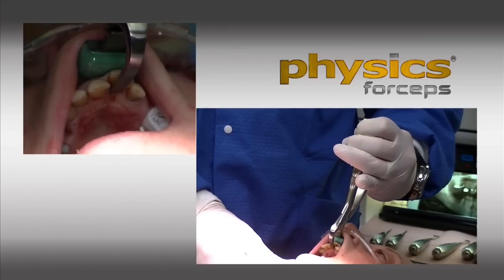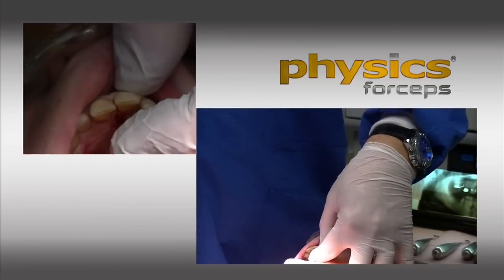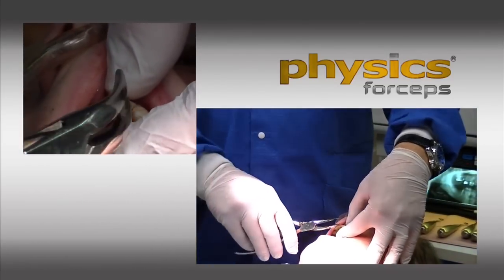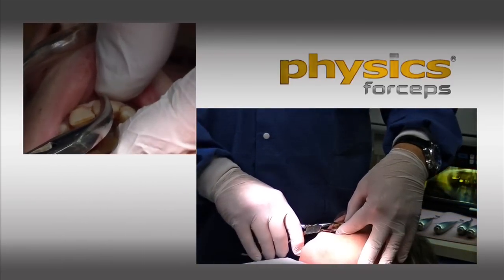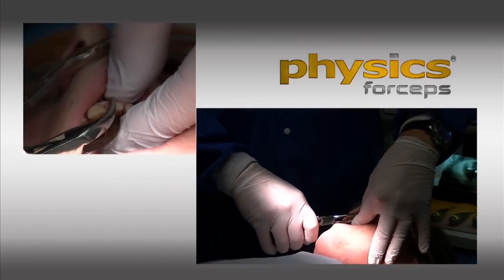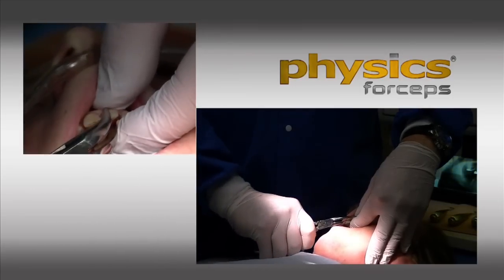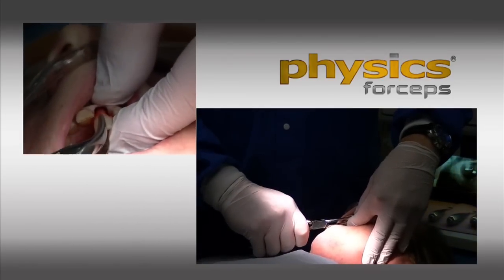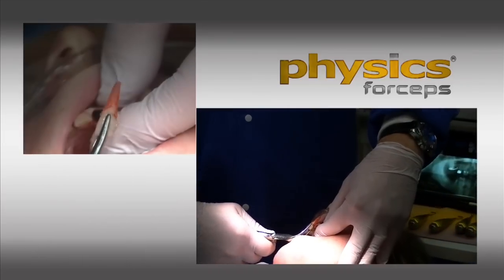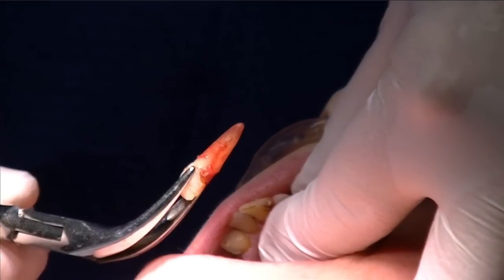Now the forceps is not intended to remove the tooth in total, rather it creates hyaluronidase, which simply breaks down the PDL fibers, or the septal fibers, which allows extraction. Now I'm also going to put implants in this area, so the buccal plate is very important to me. And I'm just simply rotating, rotating, and look at the length of that tooth. That's got to be an inch long. And the buccal plate is totally intact. So just an amazing extraction.